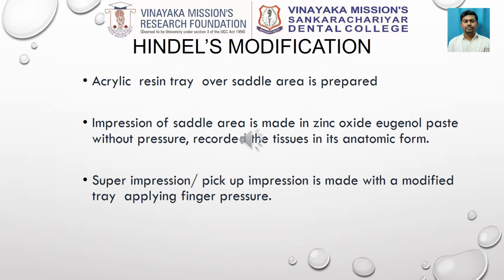Hence, Hindel came out with a modification, and this modification only involves your stock tray, not your custom tray. So it was the same procedure like before. An acrylic resin tray over the saddle is prepared. An impression of the saddle area is made with zinc oxide eugenol paste.